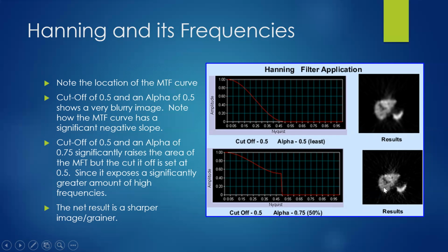Do you like one versus the other? Man, that's really kind of hard to tell, but looks like we got something going on here and also here. And again, I see the objects here, maybe also something in this area of the lobe being photopenic.